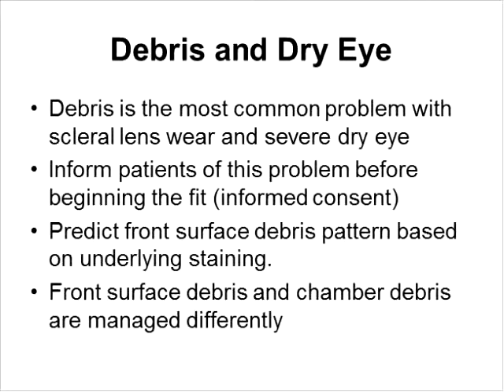What's helpful is to actually establish your patient's expectations prior to the fitting process. So it's not a surprise when they're battling with it, because you and the patient will be battling with this problem. You can predict the front surface debris based on their entering baseline staining also. And sometimes it helps you manage the patient and how you're going to treat them. And managing the debris from the front surface versus the chamber can be managed completely differently.